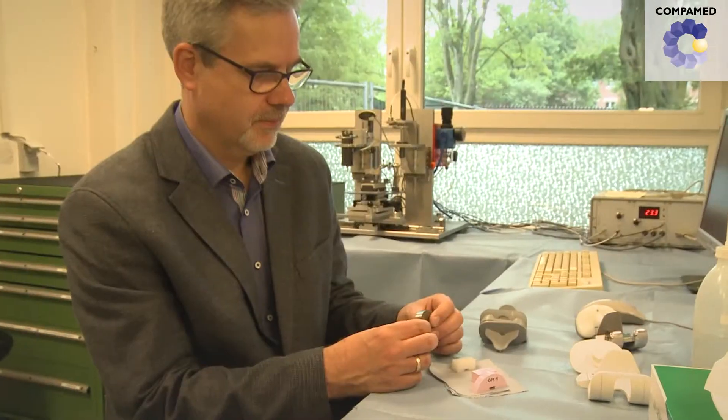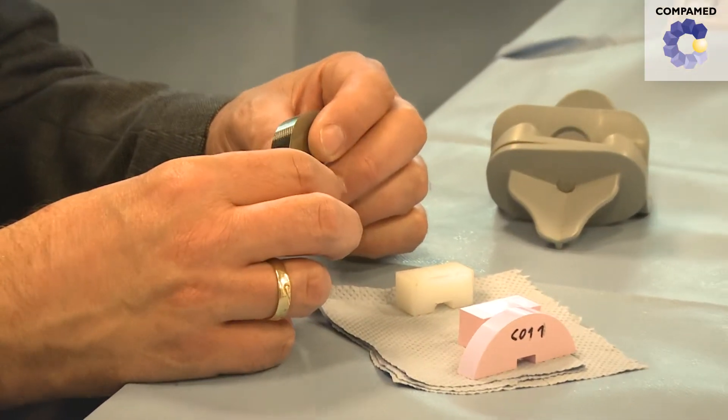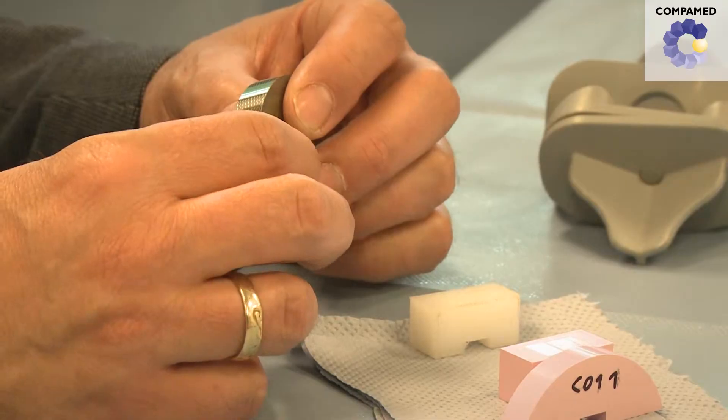Our studies on wear and tear of these ceramic prosthetics have shown that we were also able to verify reduced wear and tear in this instance, which is comparatively as low as we have already seen with the artificial hip, and we assume that this can then also be carried over to a finished prosthetic knee product.